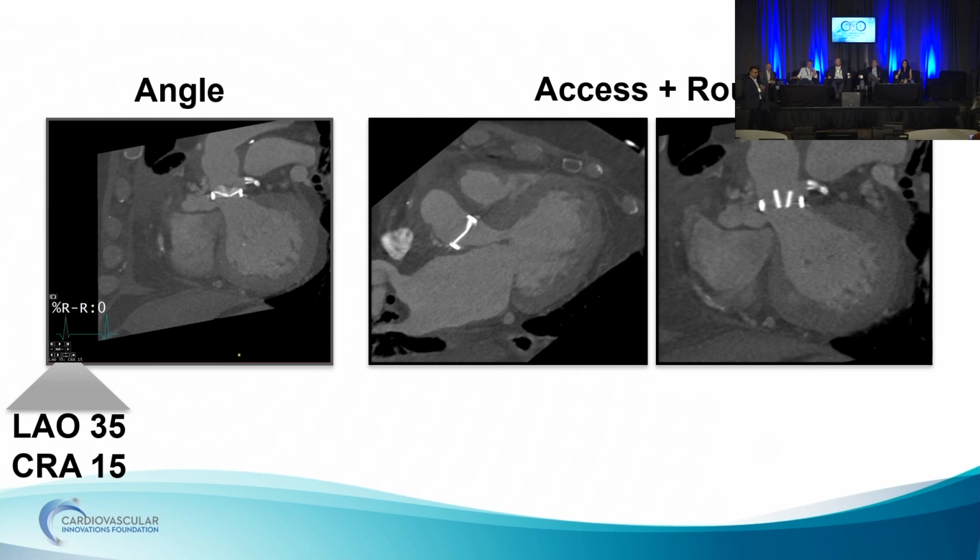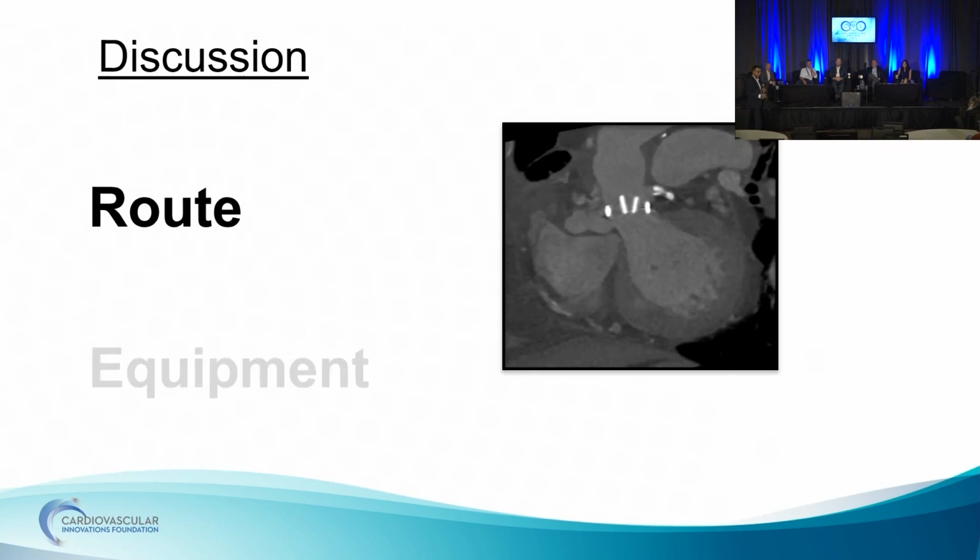Yeah. So part of the pre-planning, from my imaging perspective, is to show him an angle that's reasonable. On the CT you can make whatever reformat you can look for, but if it's a really steep angle, that's not going to be helpful for you. So that's part of what Abdallah and I talk about all the time: I get him something realistic to look at so that he's able to see what that valve actually looks like and where the pseudoaneurysm is in relation to it.